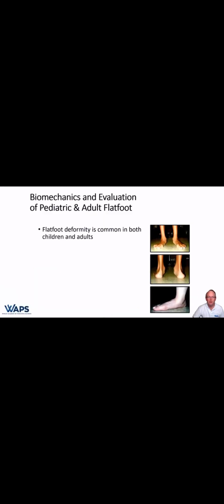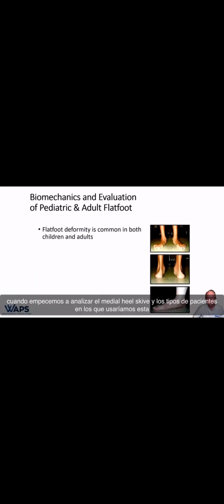Hi, this is Dr. Kevin Kirby, and I want to continue my series on the medial and lateral heel skive techniques now. When we start looking at the medial heel skive and the types of patients that we would use this orthosis technique on, it's evident that they work best and make the most biomechanical sense to use on patients who suffer from subtalar joint pronation-related pathologies.